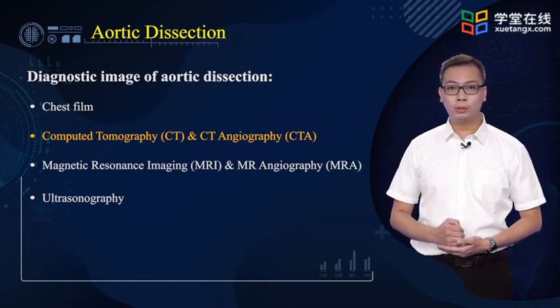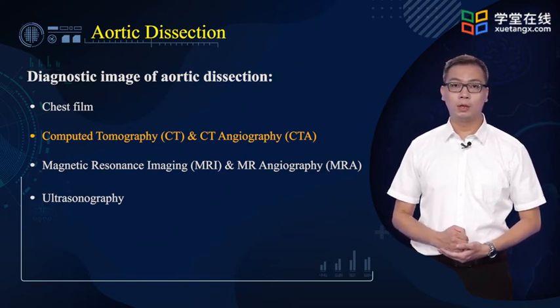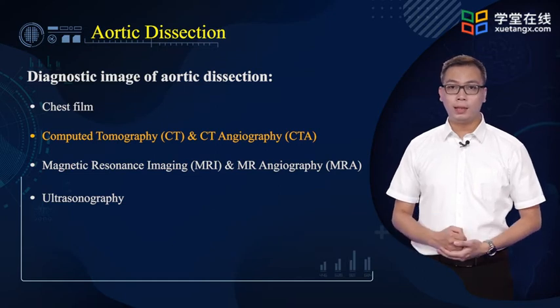CTA is the most common diagnostic image used in clinical practice. What's the reason? Let's take a look at the various diagnostic modes.